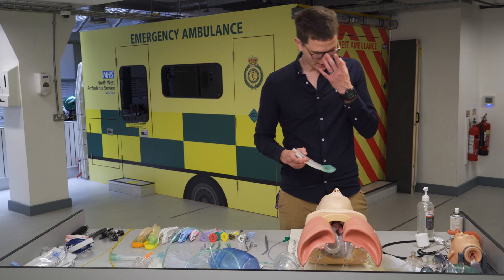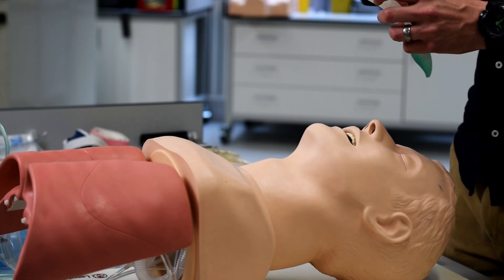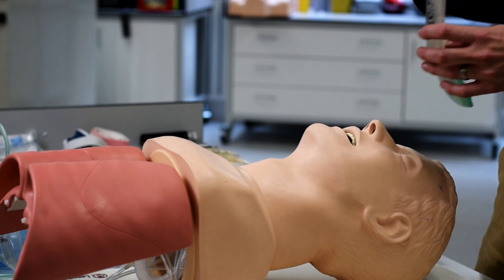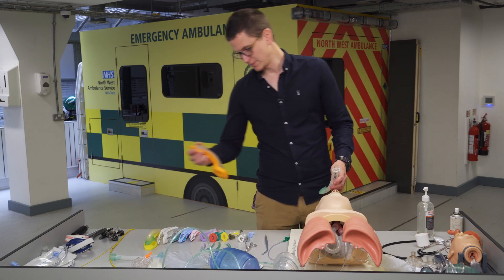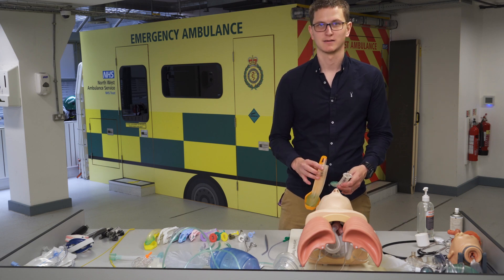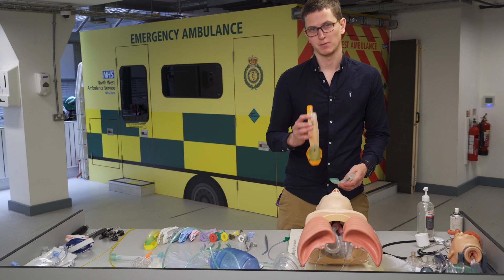How do we insert this device and how do we know we've got the right size? This is a 2.5, which is for 25 to 35 kilograms — probably a child or small adult. The biggest one we have is a size 5, which is for a 90-plus kilogram adult.